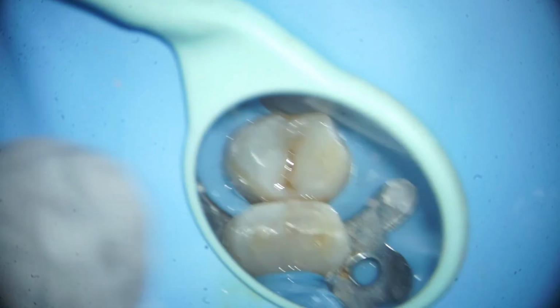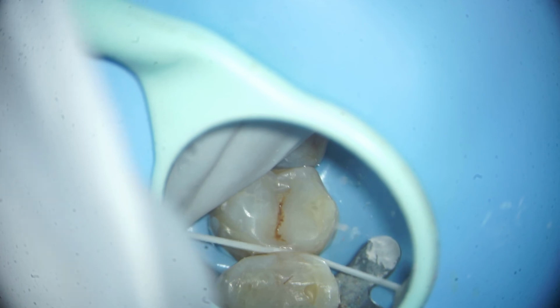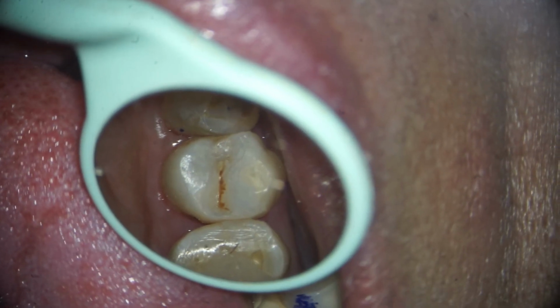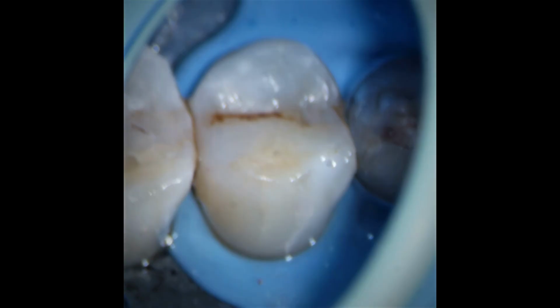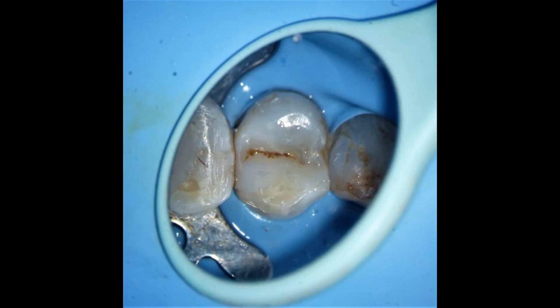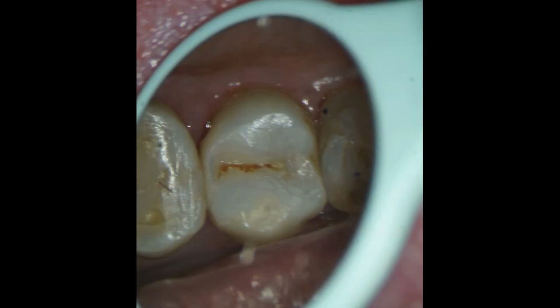So our restoration is almost finished, and you can see a neat and clean restoration with tight contacts complete. And now these are the pictures after removing the rubber dam. So now this is where we started, and this is where we could finish.